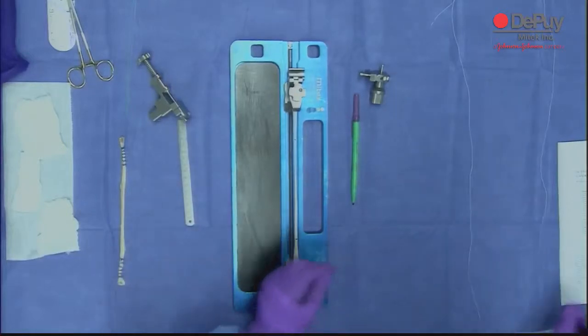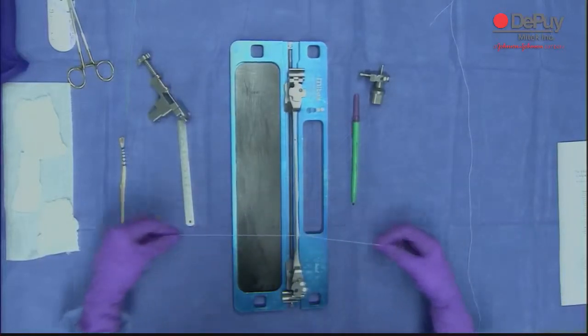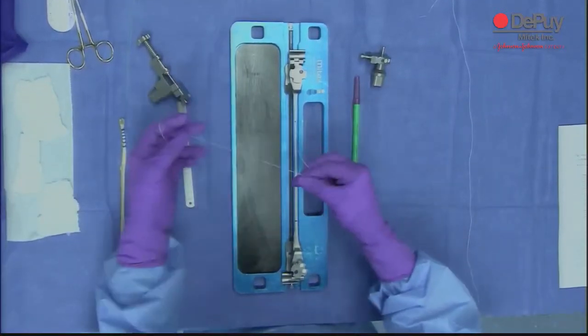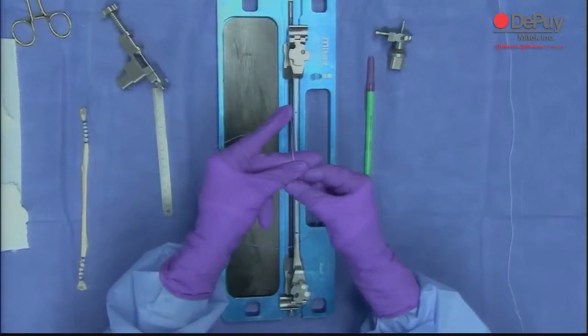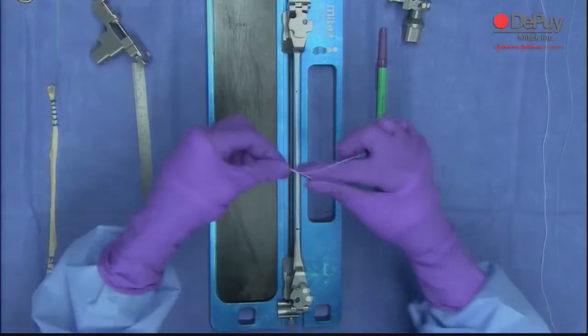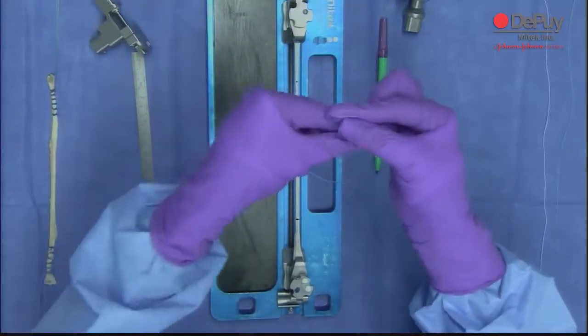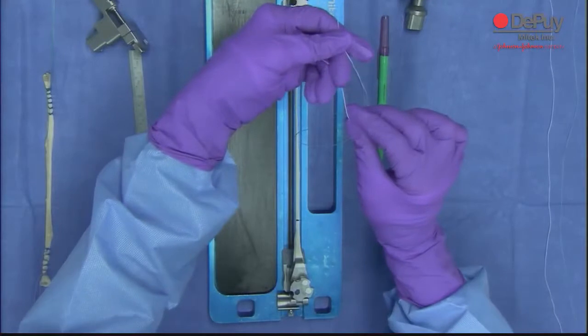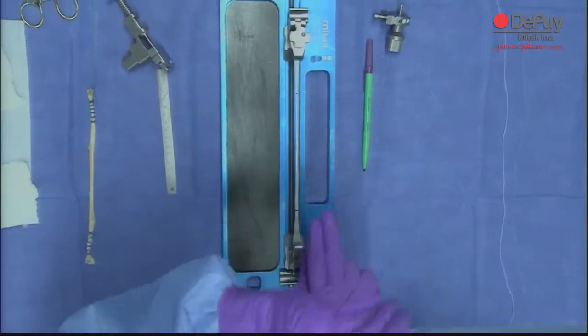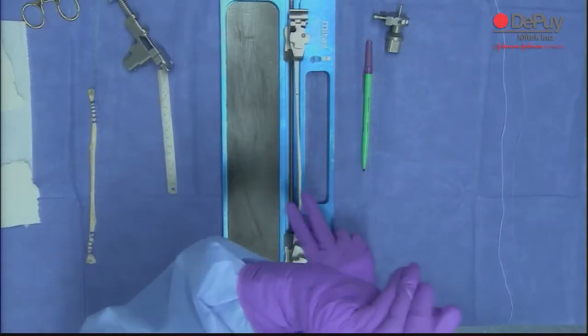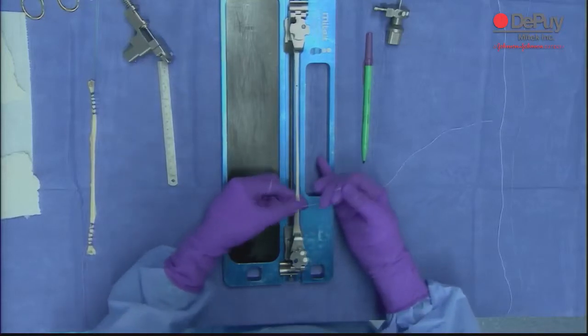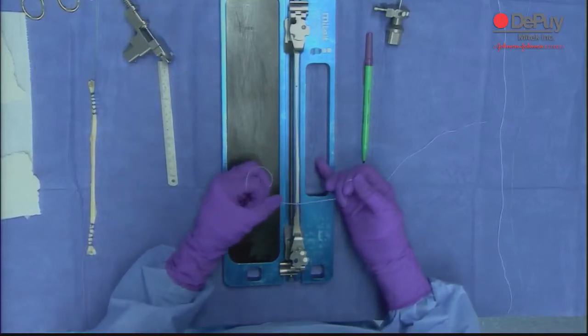Now I'm going to take a number two orthochord, and to start with, I do a surgeon's knot, which means you bring this through one, two times. I hold the two pieces of suture together, bring it out tight, put two fingers in here and push the suture down. That way I get two even lengths of suture. I'm going to tighten it up right there at the 40 mark.